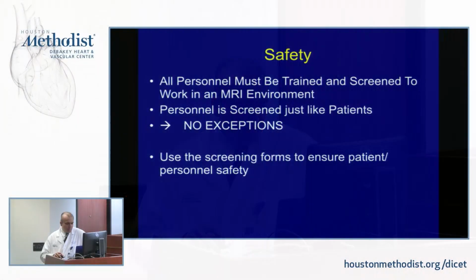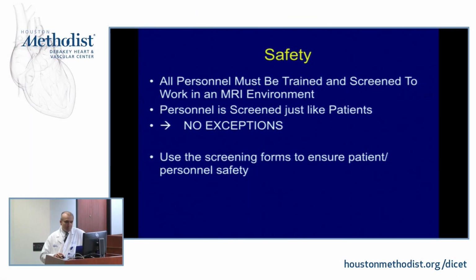Now, a few other things: if you happen to have ferromagnetic objects on you, then you probably don't want to work in the MRI suite. You probably don't want to go inside of it. So you need to be aware that if you're rotating through the lab and you happen to have a pacemaker or defibrillator, you don't want to be the one going inside the MRI scanner.